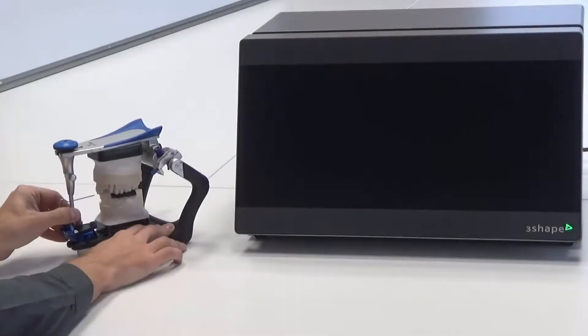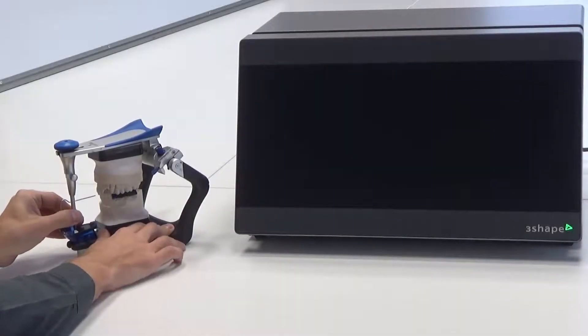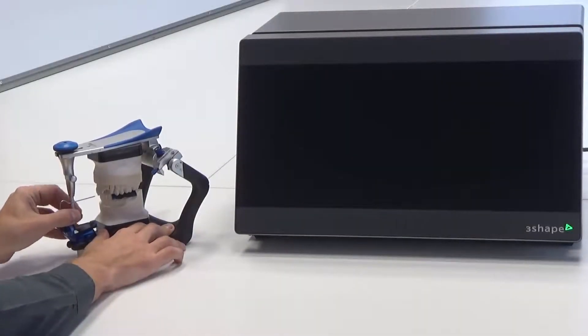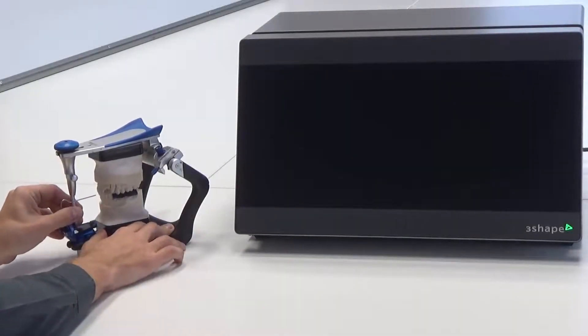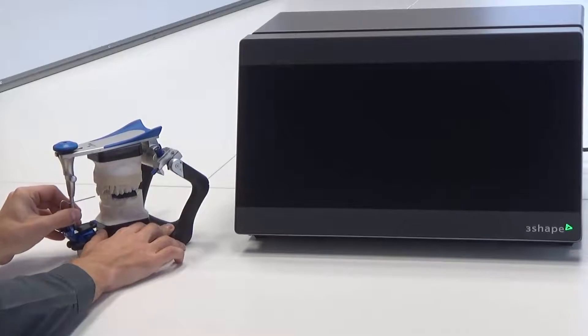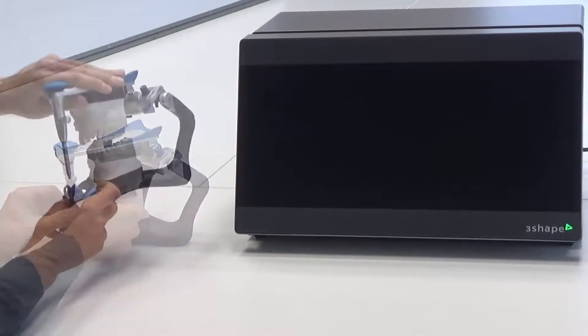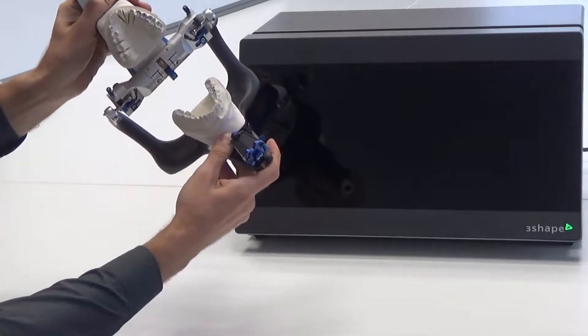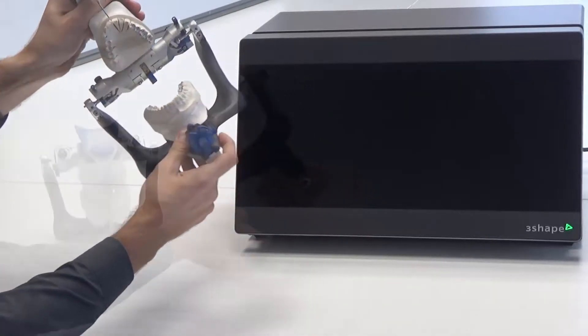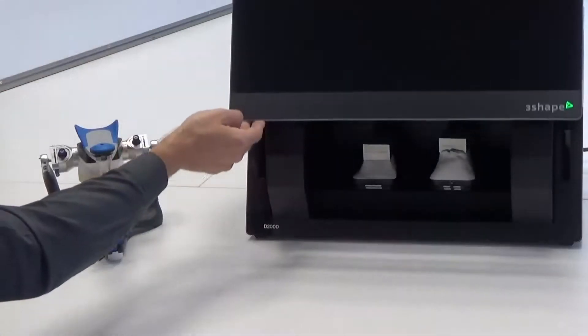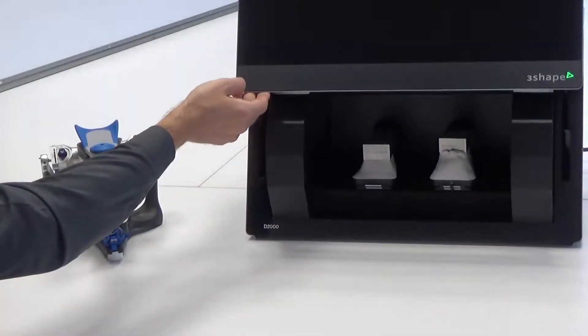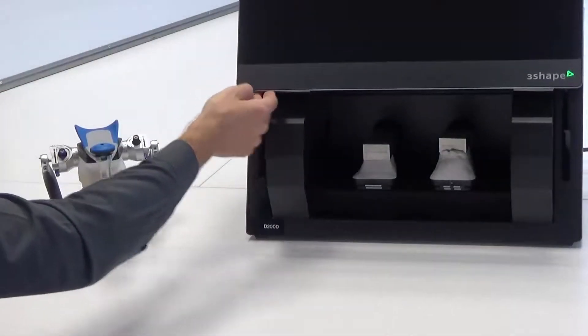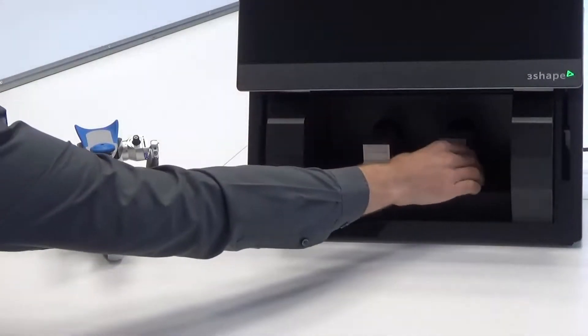You can check the occlusal contacts using occlusal paper, and then use the contact points as reference points in conjunction with the digital scan. Remove the occlusal transfer calibration object from the scanner.